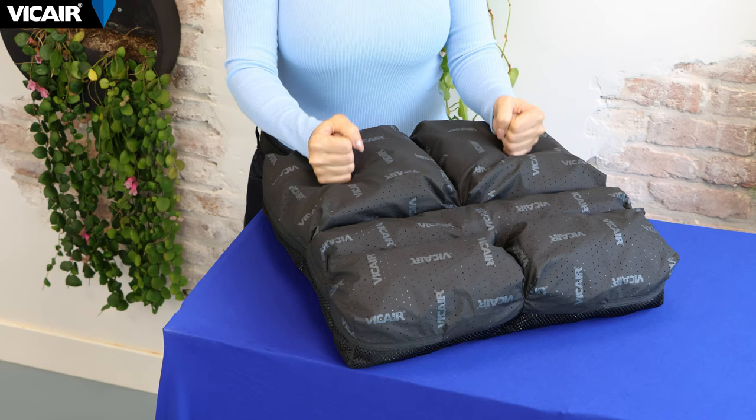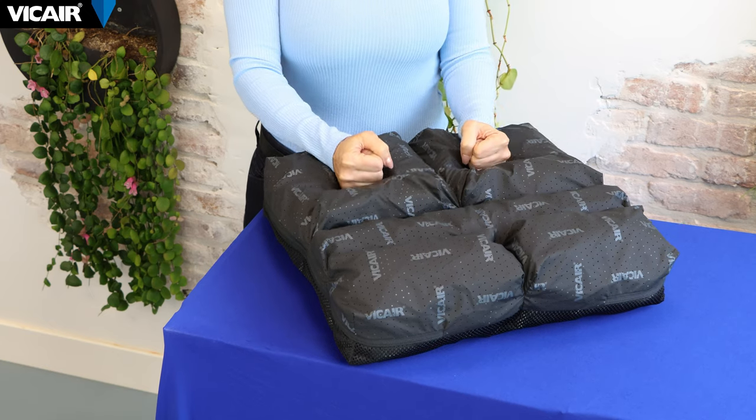In this video, we will talk about the features and applications of the V-Care Adjuster O2 wheelchair cushion. The Adjuster O2 consists of five individual compartments designed to contour under loading. This means that when you sit down on the cushion, it will automatically adjust to the shape of your body, hence the name Adjuster.